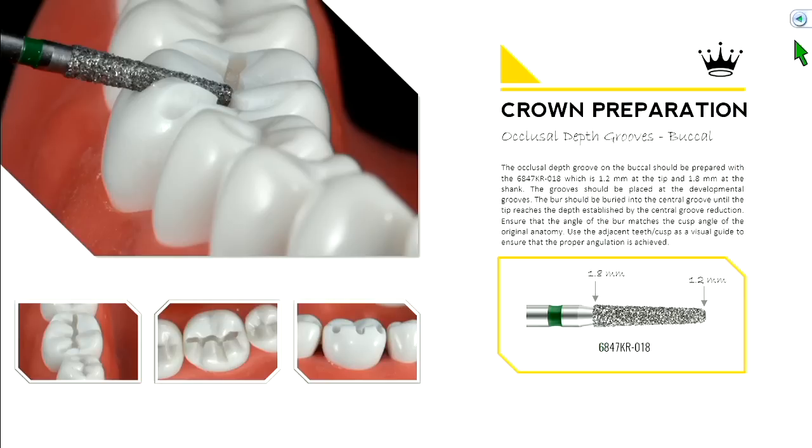If you think of right dead center of that burr, that's about 1.5 millimeters — you can use this burr as a gauge as you reduce. Sink that burr so it's reduced about 1.5 millimeters. The goal is to take the tip and sink it into the bottom of your central groove reduction established at 1.5 millimeters, maintaining the angle of the burr so it's uniformly reduced — the inclination of the cusp tip should be reflected by the angle at which you hold your burr.